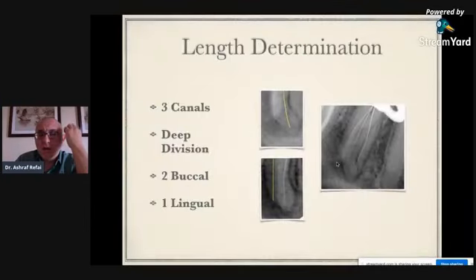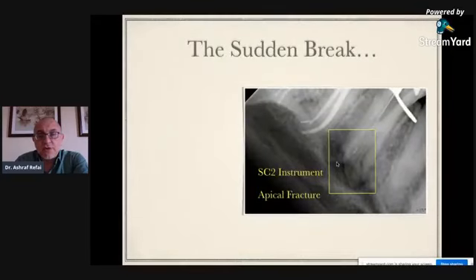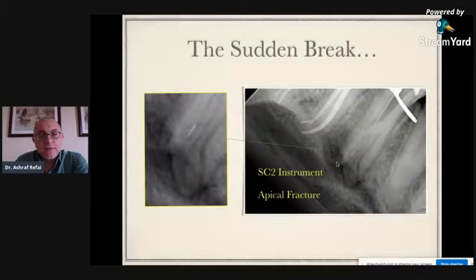So this patient was referred. She was the daughter of a dentist, so I was being very, very careful. And I started doing my preoperative, and I started taking my working lengths. And then during the instrumentation, what happened? I had an instrument fracture of an SC2 instrument from the Revo S system. It was out of the box, and it was a new file in a straight portion of the canal.